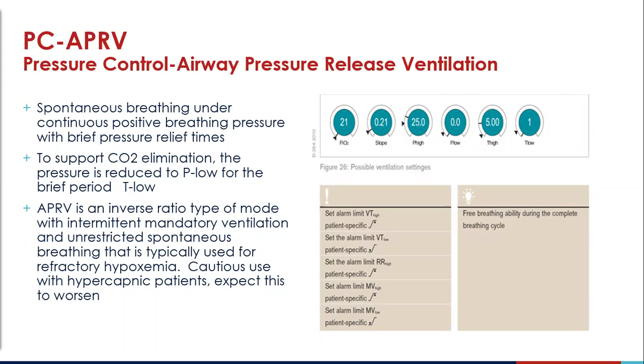This is a unique mode which is primarily used with patients with issues such as acute respiratory distress syndrome, or ARDS.